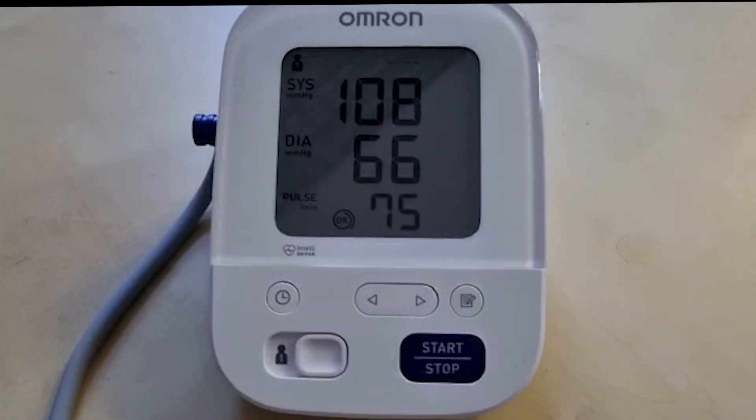The first reading you take can often be high. Wait two minutes then take the reading again. You can then work out the average reading of the two. Write down the results and take your blood pressure at the same time each day.